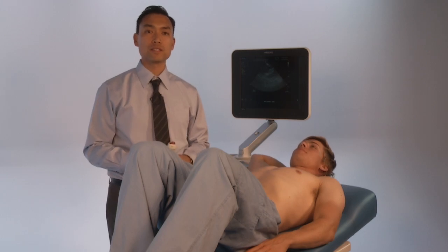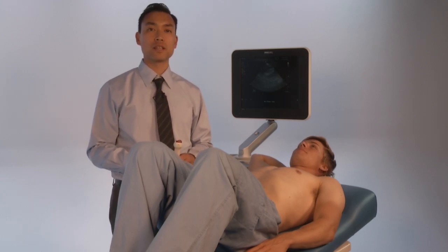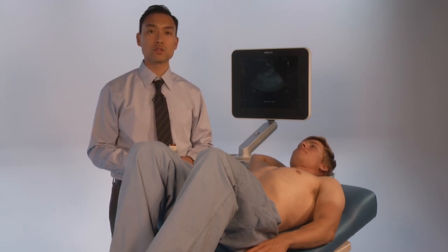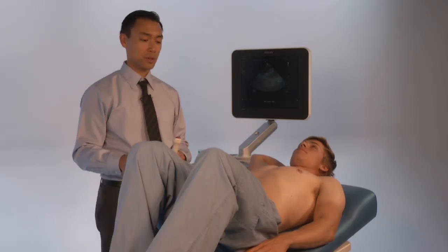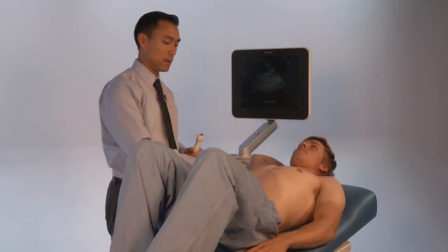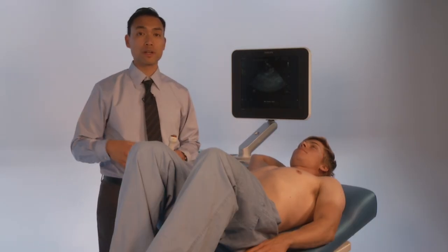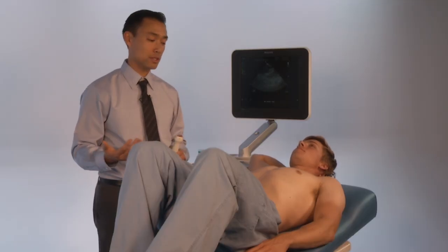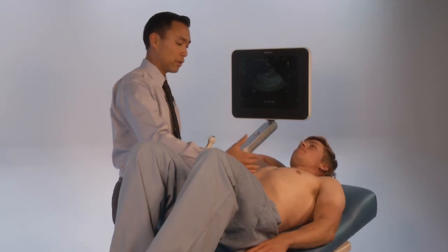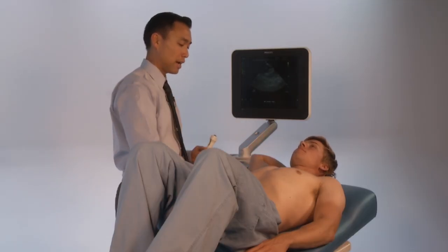Now we're going to do thoracic scanning using ultrasound and how to evaluate the thoracic cavity. With the patient in supine position, we're going to examine the patient in six different portions of the thorax per side.